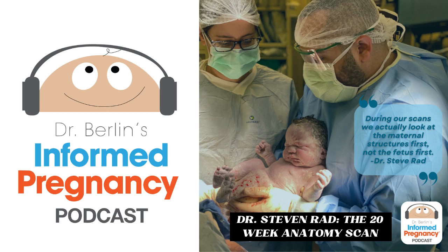And then you can move it around and look around the kidneys literally in 3 dimensions and look at it from each view. Because each view, for example, if you're looking at a view of the brain, flat or axial versus sideways versus a middle slice, each gives you a different piece of information at that level of the brain, kind of like an MRI machine does, and it reconstructs the brain for you.